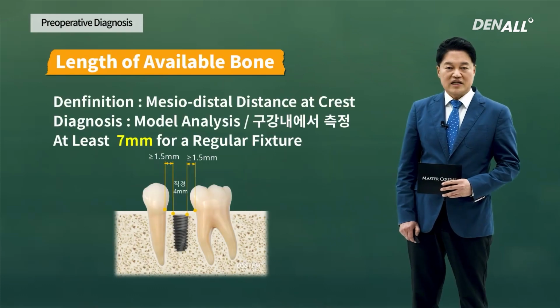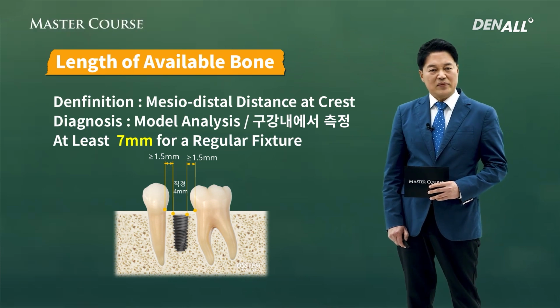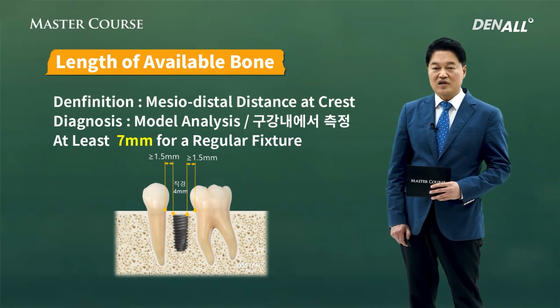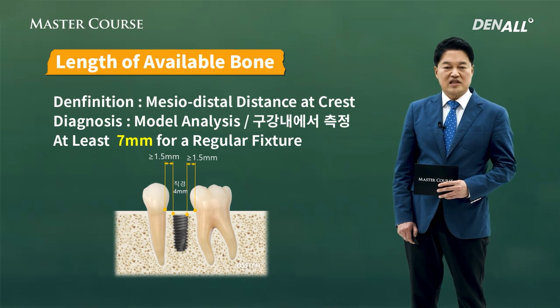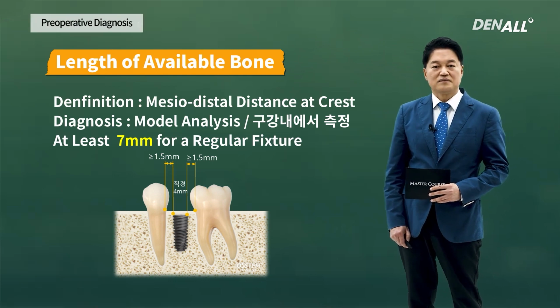As I've mentioned, the length between natural teeth and fixture needs to be at least 1.5 millimeters. If you are going to place a 4 millimeter diameter fixture on both sides, you need 1.5 millimeters, so a total of 7 millimeters of mesiodistal distance is required. If you're going to place a diameter 5 millimeter implant, the mesiodistal distance needs to be at least 8 millimeters.